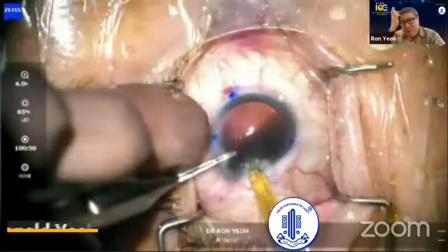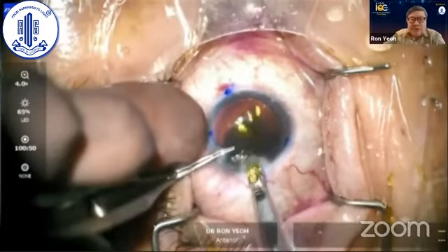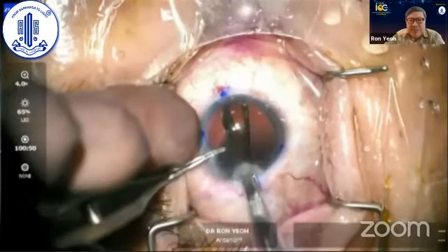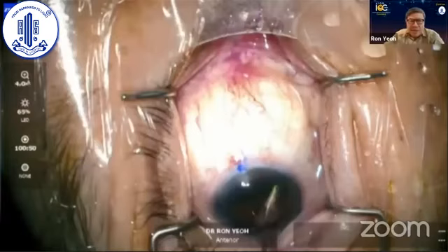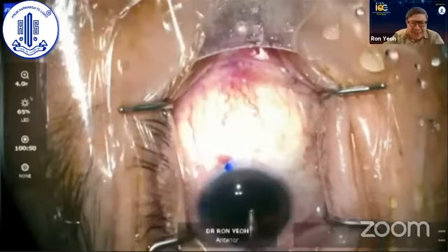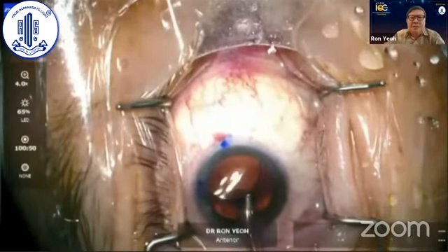Let's look at this case in which I'm injecting a toric lens into the eye. So the toric lens has gone in, and I always go behind the lens to remove OVD. And here you can see my IA tip has gone behind the lens. I'm just aspirating gently. I'm really not doing very much. And then as I come out, I see that line there. Can you all see that line diagonally across that?